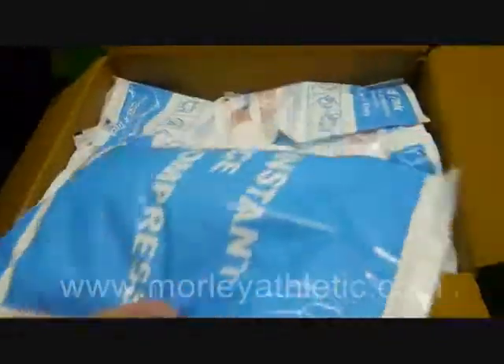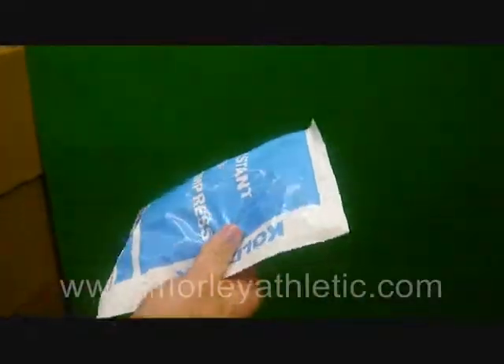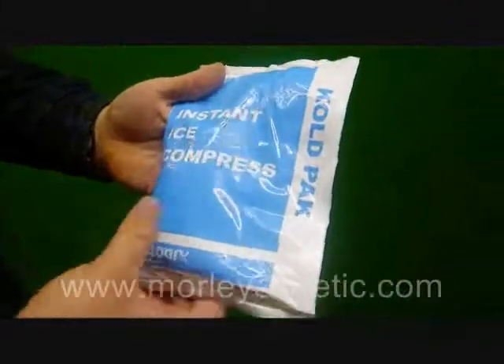I'm going to take one out and show it to you a little bit closer here. Put that aside. As you can see, these are Instant Ice Compress.